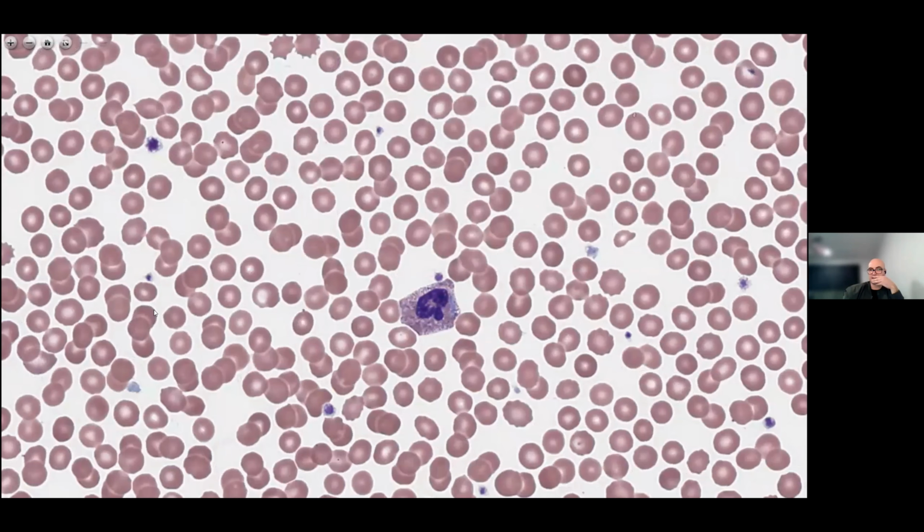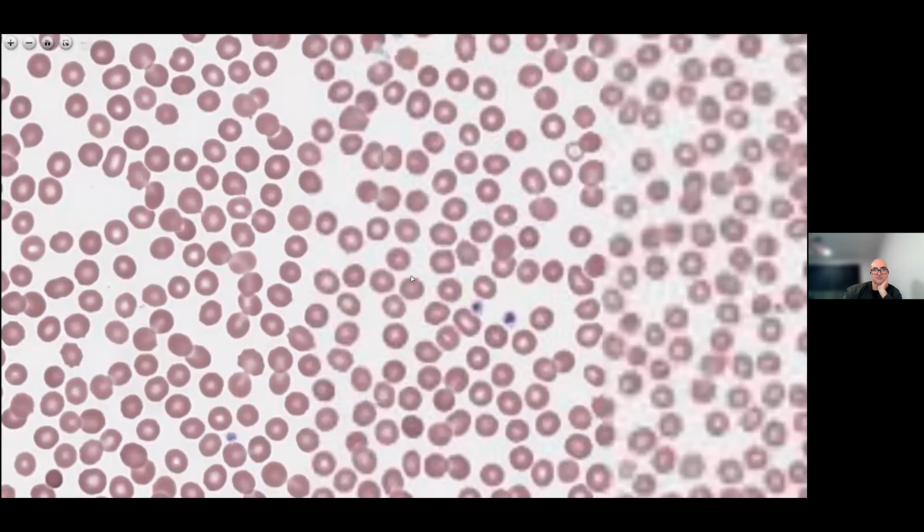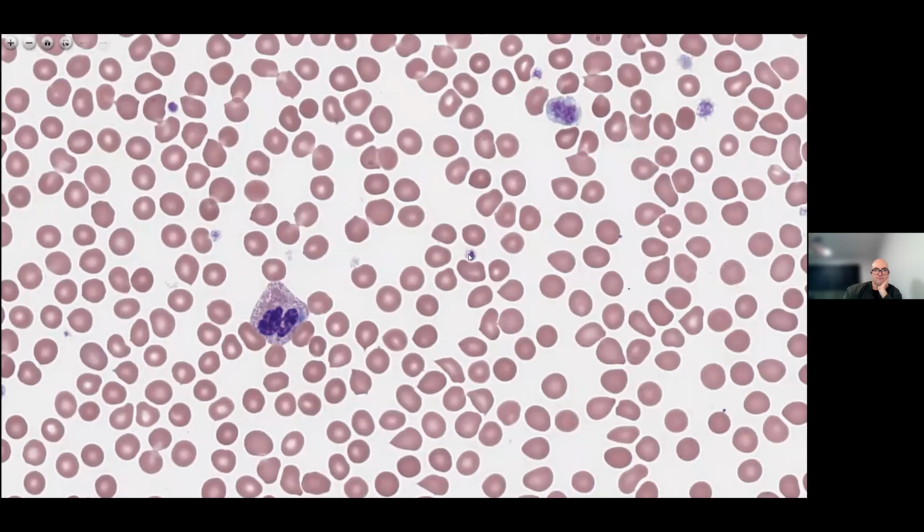So yeah, it's a tricky film. It's tricky but interesting one. This patient did have May-Hegglin anomaly, and like you said, generally these patients don't have a huge amount of problems with bleeding, and if they do, it's very mild. But I think the modern way of describing these conditions is related to a mutation in MYH9. I'm not sure whether you've come across these kind of issues. If you had any comments.